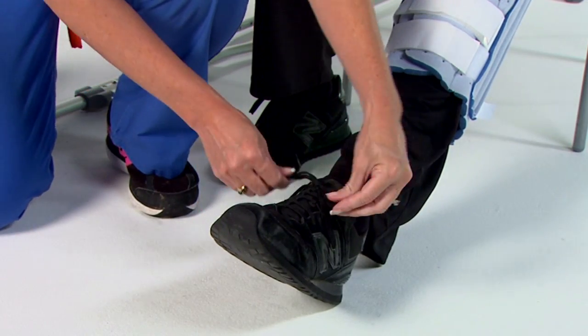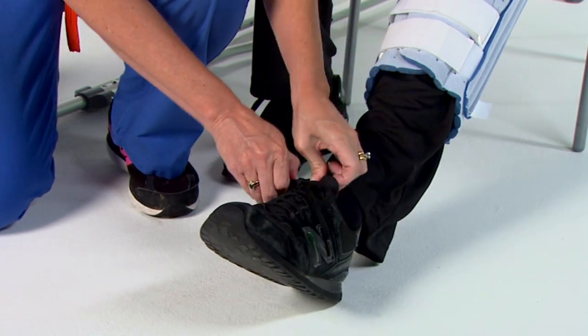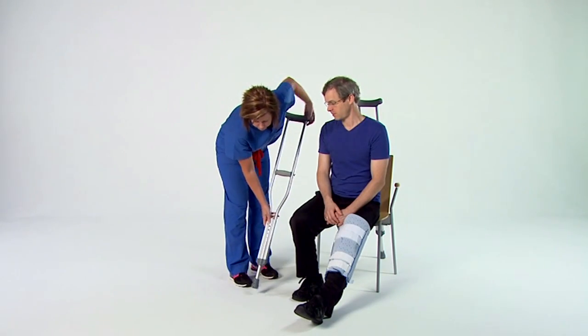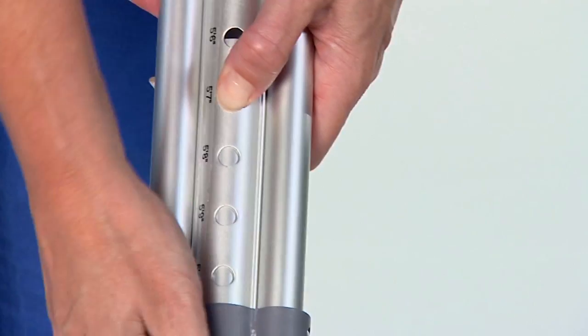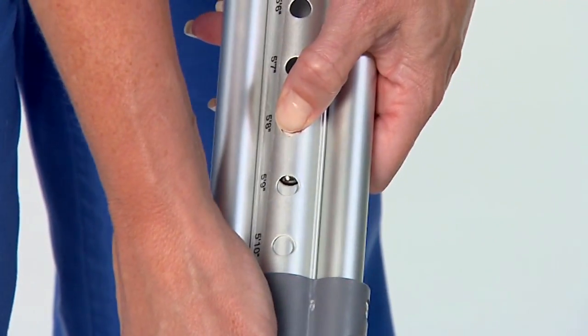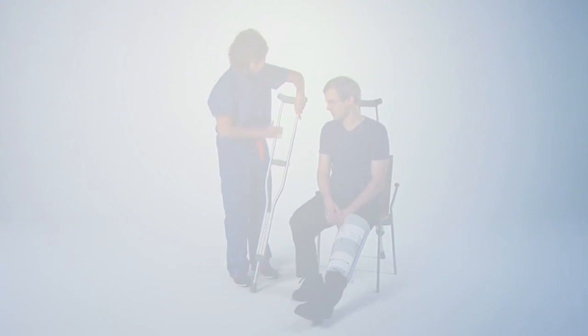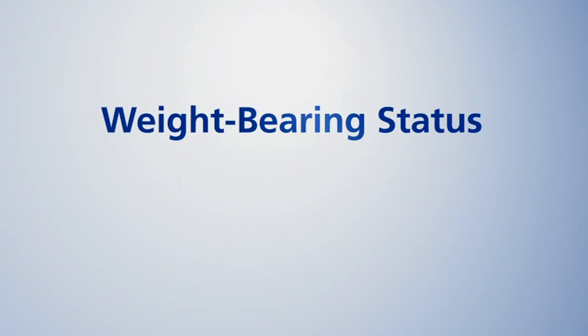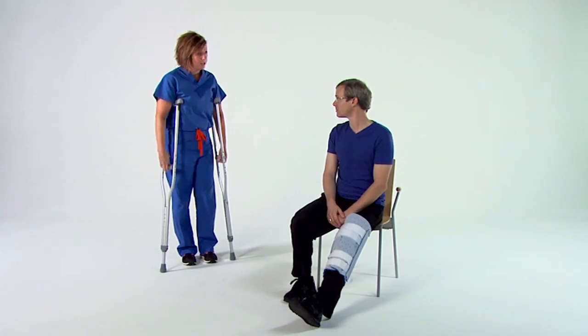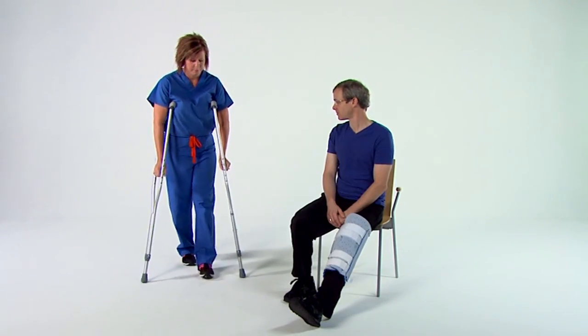Flip-flops, open-toed, and backless shoes aren't safe. A member of your care team will help make sure that your crutches are the right size for your height. You can adjust the height by pushing both buttons on the lower part of the crutches and adjusting the tip. Before you begin walking with your crutches, your doctor will inform you and your care team of the amount of weight, if any, you're permitted to put on your surgical leg. This is referred to as weight-bearing status. Please ask a member of your care team if you're unsure of your status.